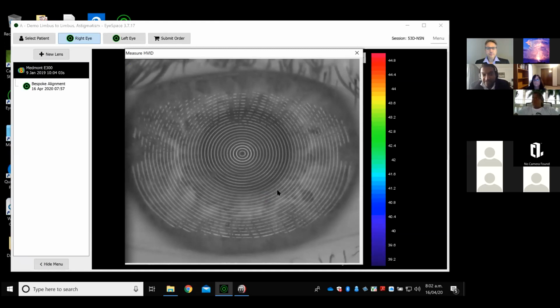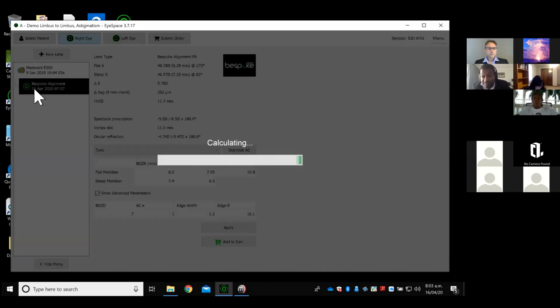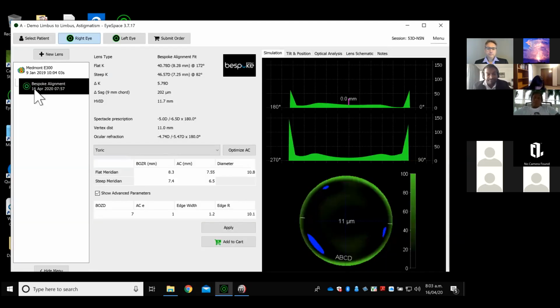If we have a patient, let's say I've got a high hyperope, and they happen to have a larger pupil than this, then I may look at potentially even increasing the back optic zone diameter, or leaving it the same, because we know that we're going to get less halos and glare or issues like that. But I always check the pupil size before I'm fitting anyway. And that may be in my topography software, not necessarily within our software.